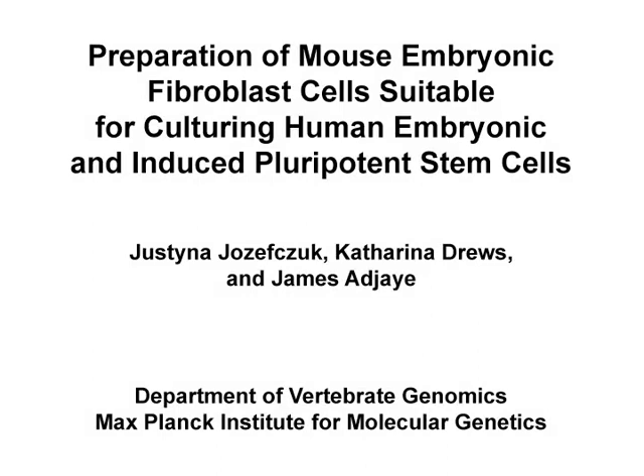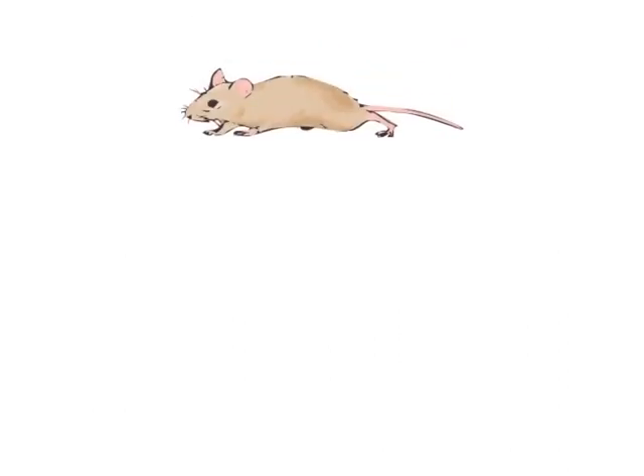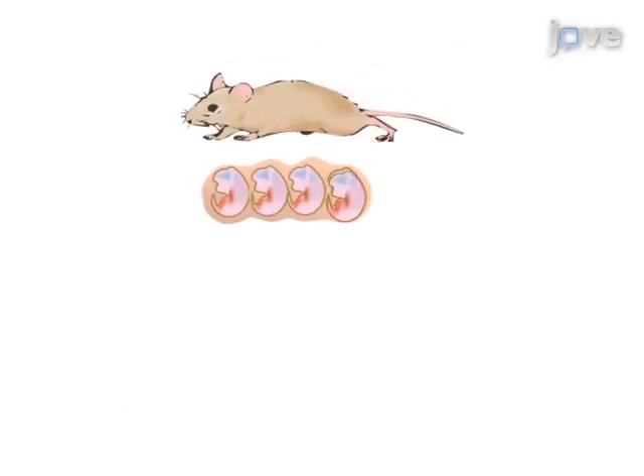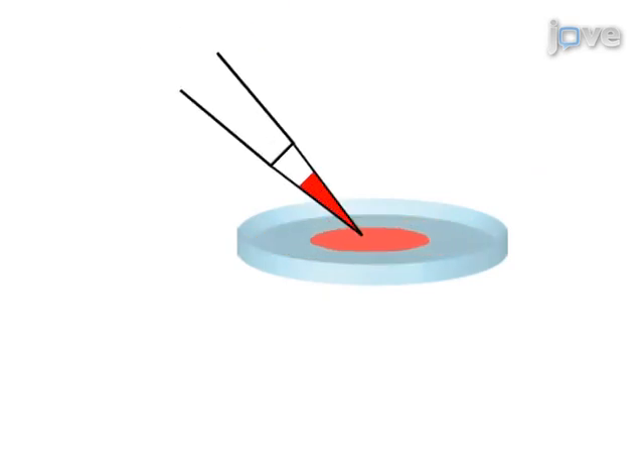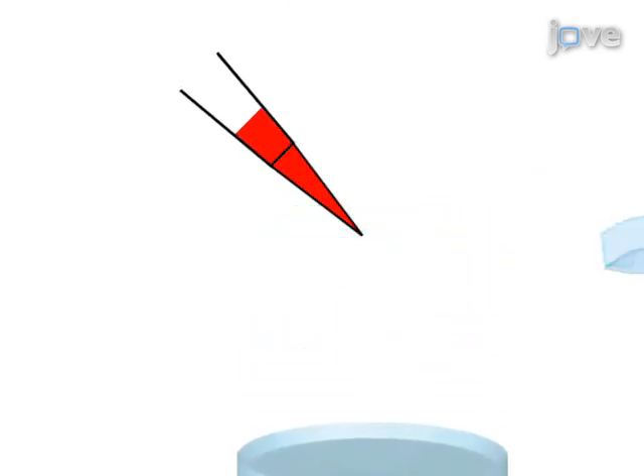The overall goal of this procedure is to prepare mouse embryonic fibroblasts suitable for culturing human embryonic stem cells and induced pluripotent stem cells. This is accomplished by first separating each embryo and removing the head and red organs. Next, the tissue is finely minced and digested. Then the cells are plated, 3-4 embryos per flask, and expanded.